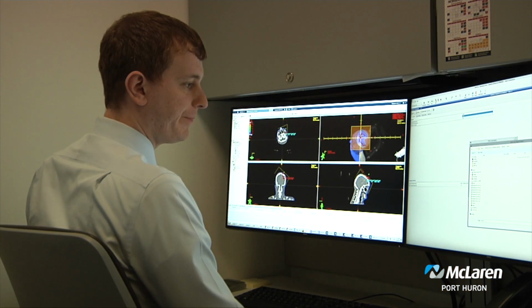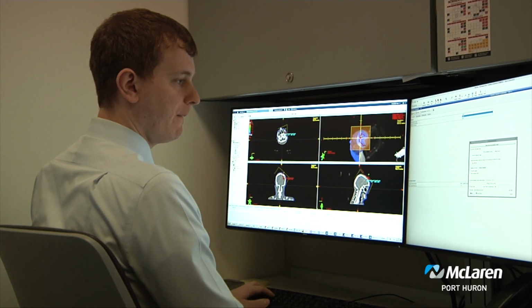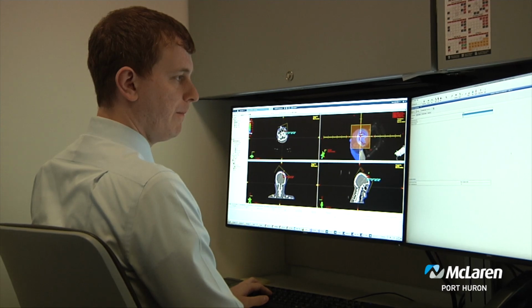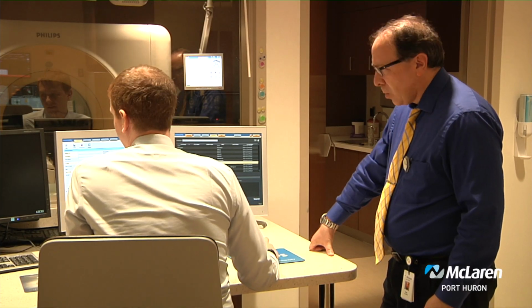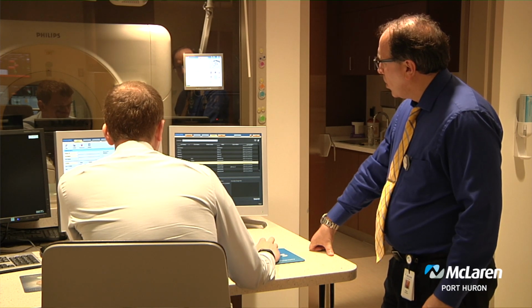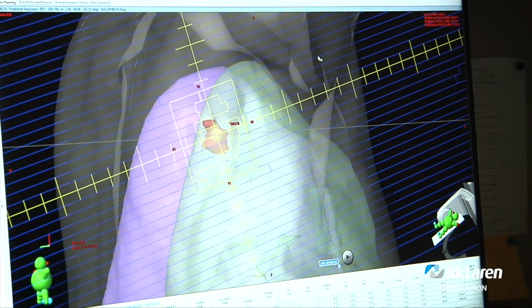So how do you interact with the patients in the cancer center? I don't have too much direct interaction. I'm mostly behind the scenes. When they come in for treatment after they get their CT simulation done, I'll work with the doctor, and we'll make sure that we're targeting their tumor correctly. We use a lot of different imaging studies as well, like a PET and MRI, and I make sure that those are linked together properly so that when they're drawing their volumes, they're accurate.